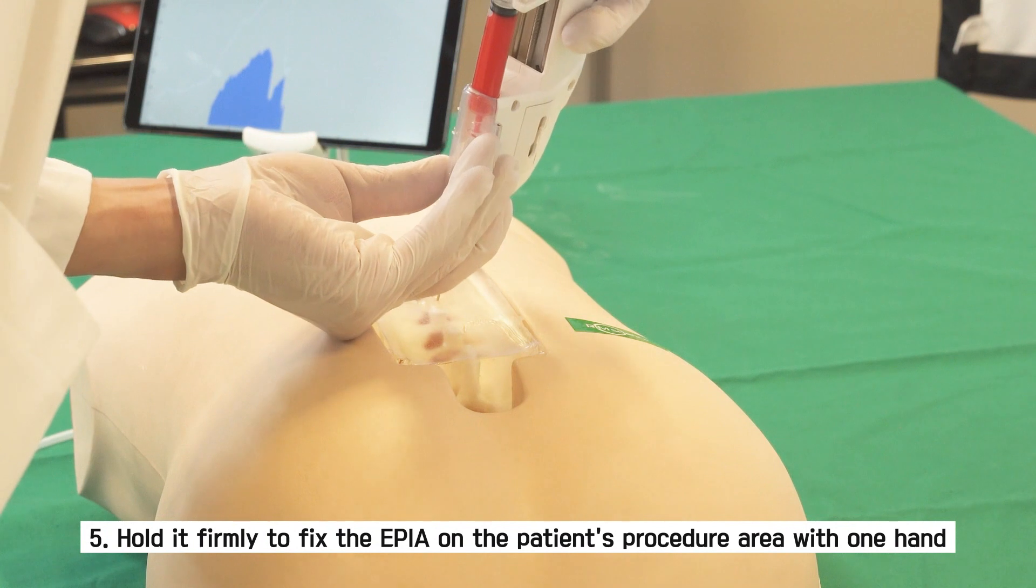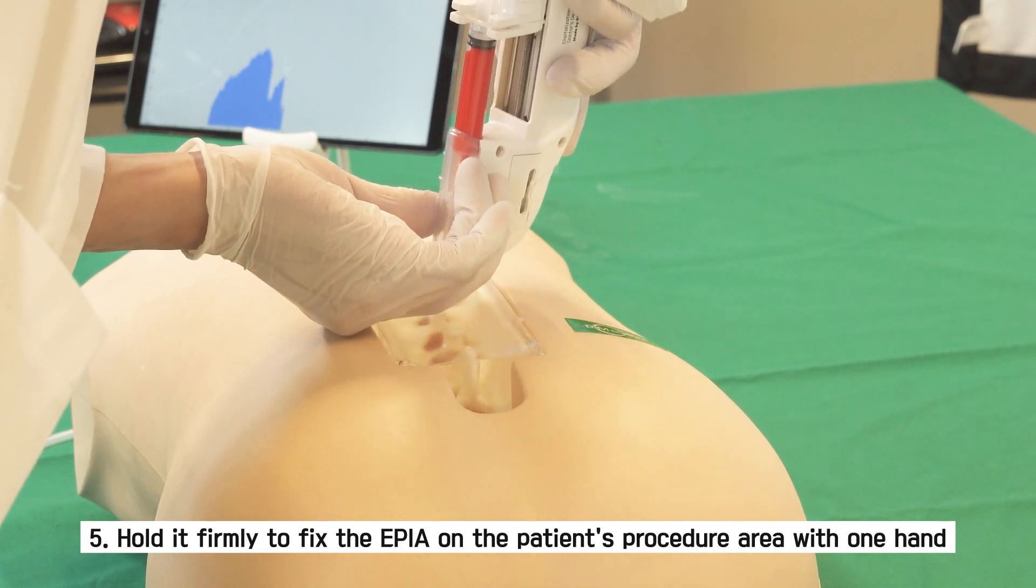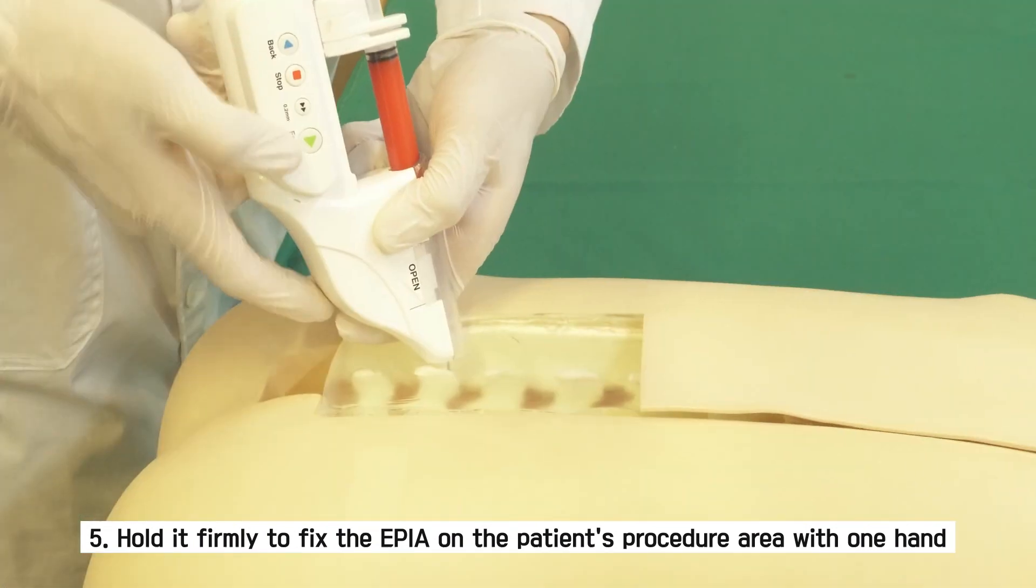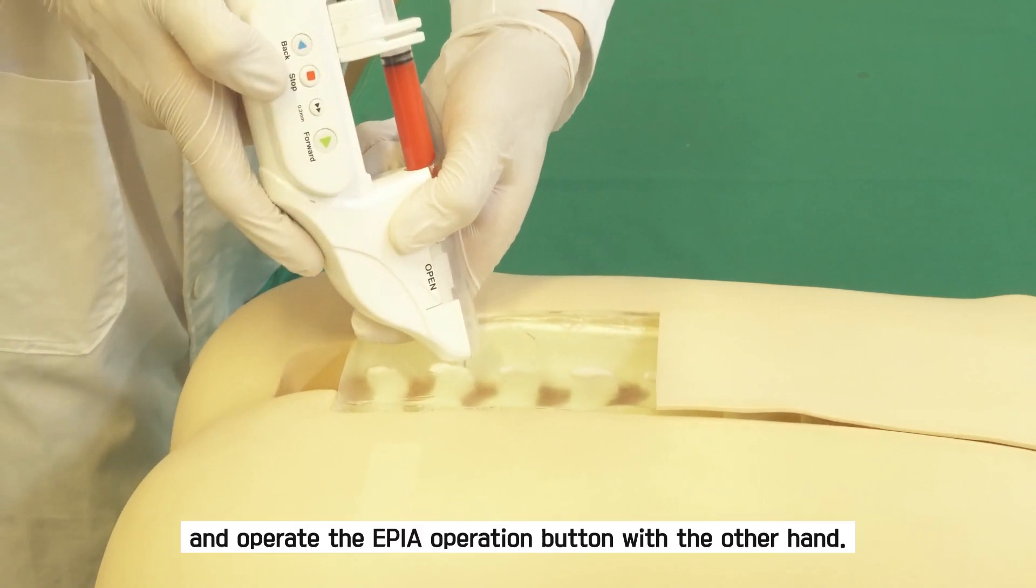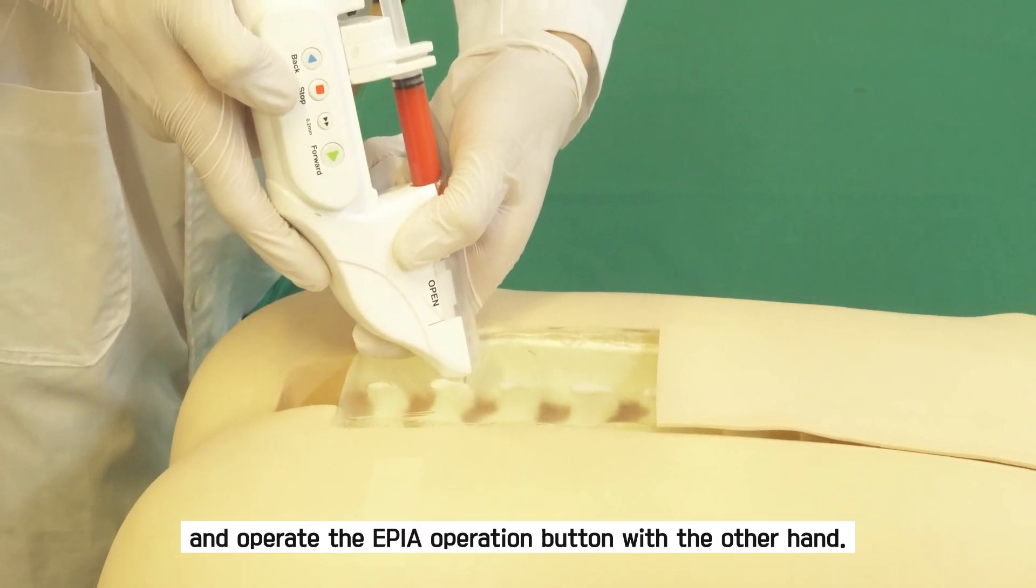Fifth, EPIA must be held firmly on the patient's procedure area with one hand and operate the EPIA operation button with the other hand.